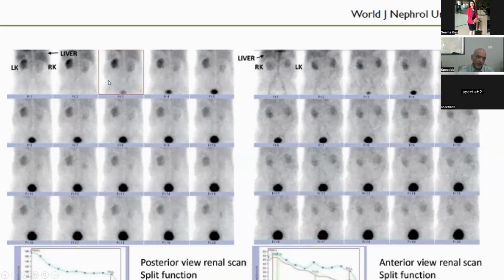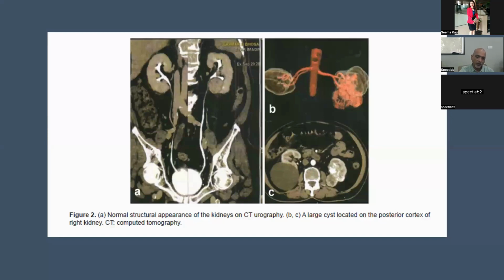And we said 18% from renal contribution here, and the surgeon calls back saying that the patient is harboring tumor on the left side, and you are saying that the right kidney is compromised in function. I can't believe it. I said, I will review the case.